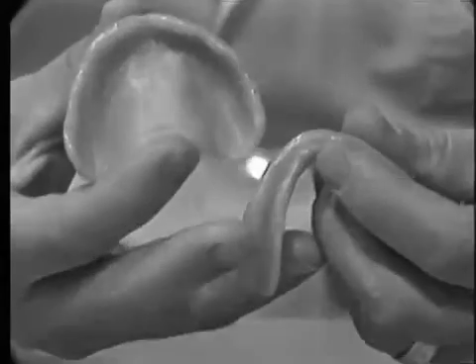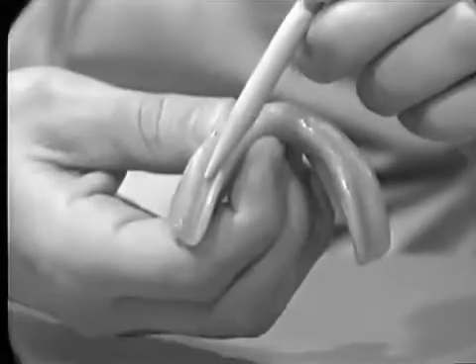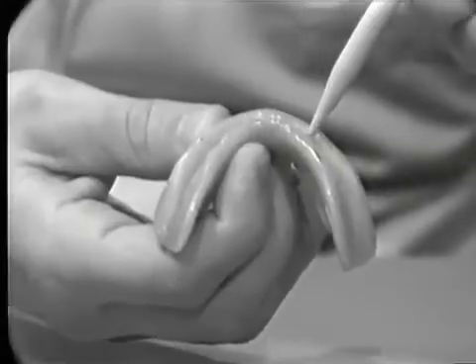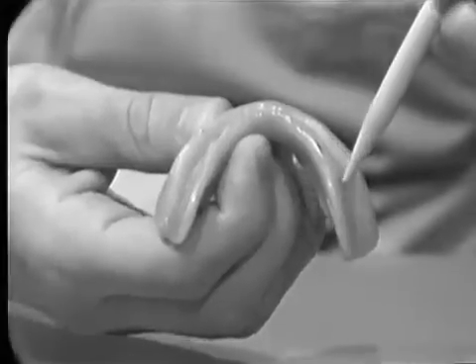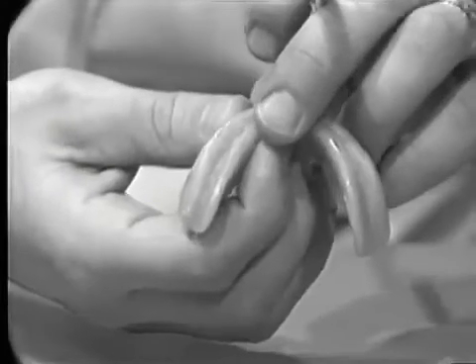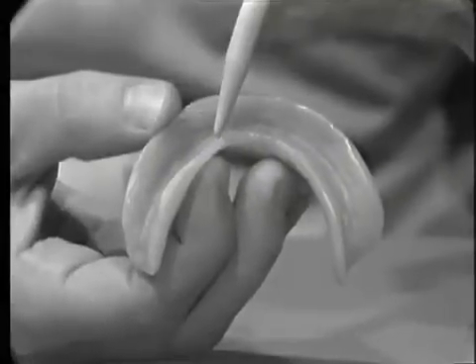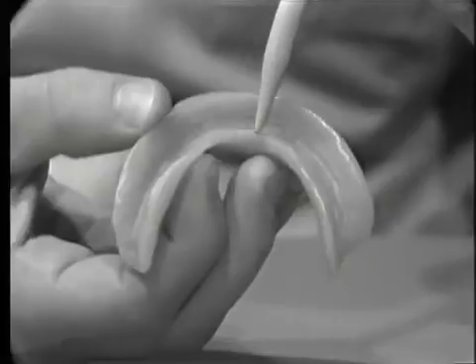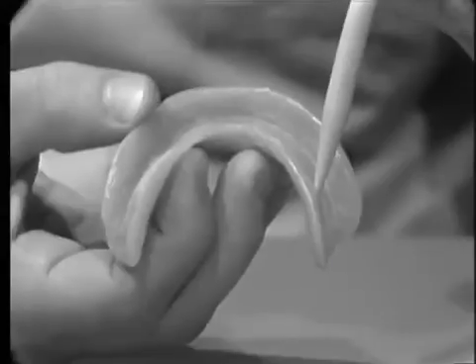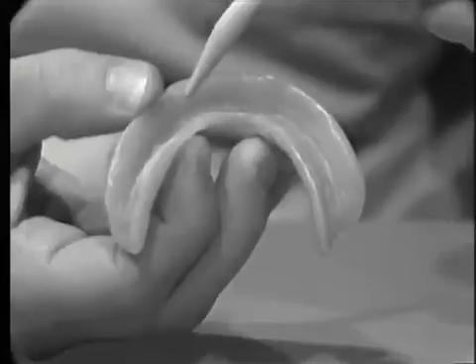Differing anatomical configurations of the denture base require various amounts of blockout media to prevent locking of the dentures on the remount cast. Only minimal amounts of any of these materials need to be used — enough to allow for easy removal of the denture from the cast, but not so much as to cause problems in placing the denture on and off the cast. If the internal surface of the denture contains no undercuts, blockout material is not to be used. However, in this example of a mandibular ridge with severe undercuts in both the anterior and posterior areas, blockout material must be used.